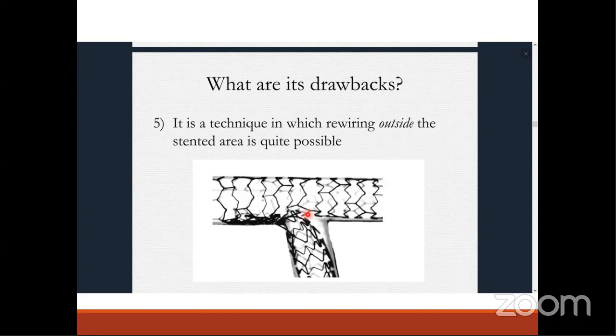The first tip is allowing an adequate area, an adequate length of the stent to be crushed. And number two, after you inflate the main vessel stent, after you inflate the side branch stent, you need to withdraw the balloon into the main vessel and perform another inflation. So the ostium of the side branch is inflated by the main stem of the balloon rather than the edge of the balloon, because the force is concentrated at this main stem.